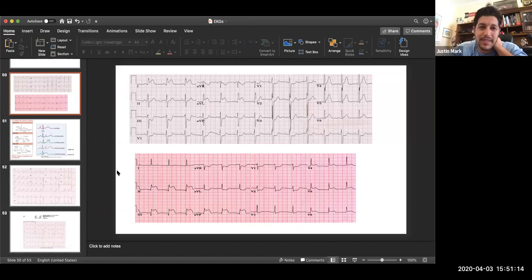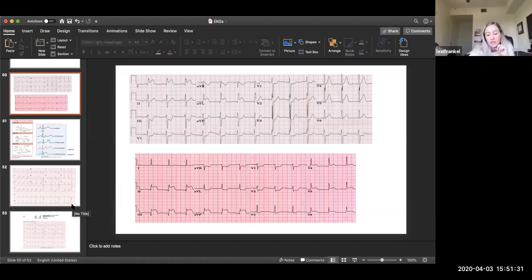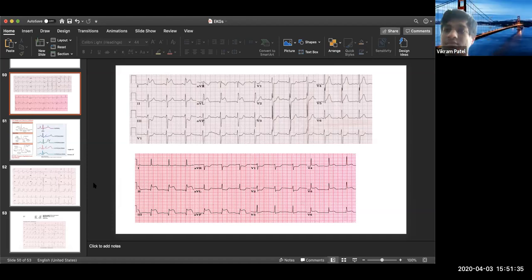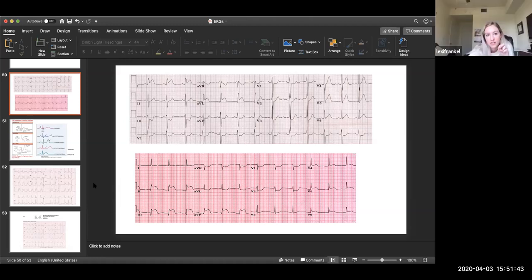I think Dr. Sizemore pointed out something in her notes. I'm just trying to find it, but I can't find it. If I find it, I'll let you know. But I think there was something else, though it's very, very rare to not have P waves. Can you have an infarct that affects the node itself? You said, can you have an infarct that affects the node, and then you wouldn't get the P waves?